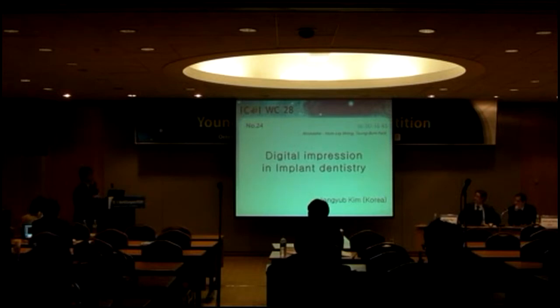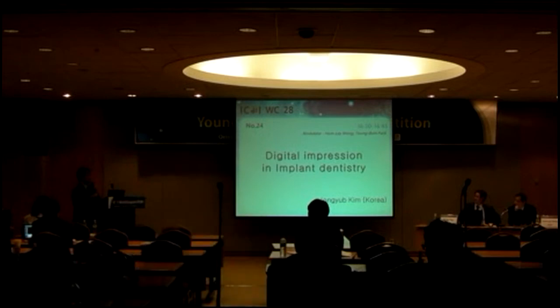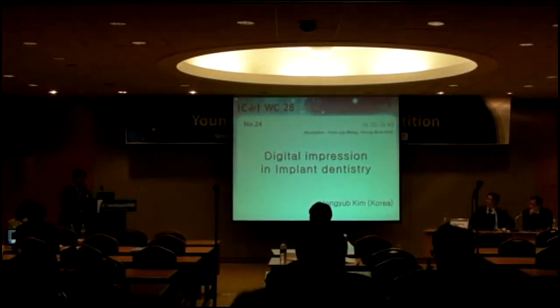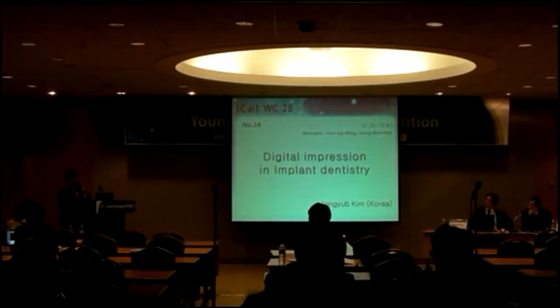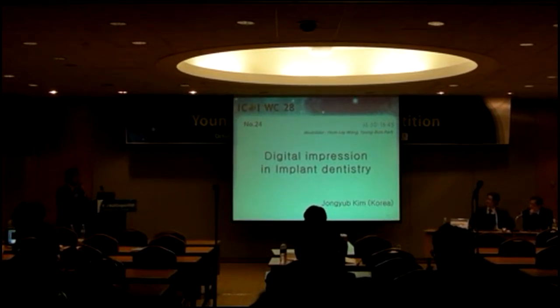So you have to have very good moisture control. If you have too much bleeding, you cannot take the pictures, because this is not taking pictures of the tooth or implant, this is taking pictures of the external surface. So if you have a contaminated surface, digital impression will not work. You have to have a clean wound, and it's better to have less reflection, like from metal restoration or amalgam filling, whatever comes with metal.